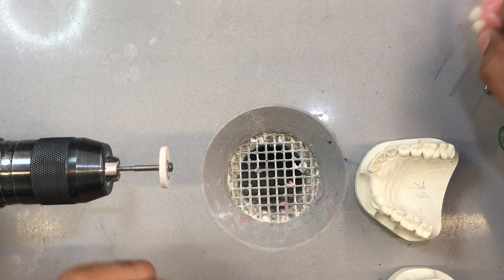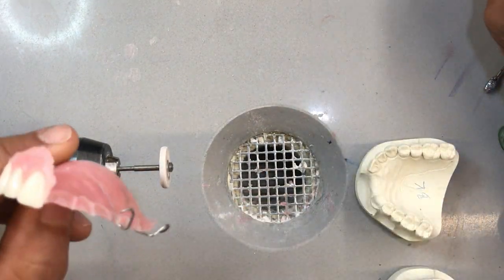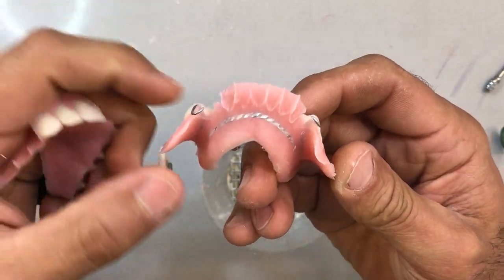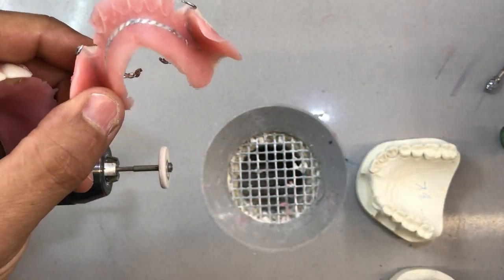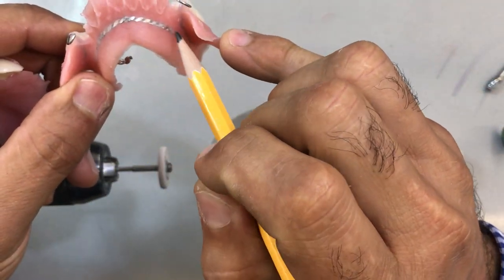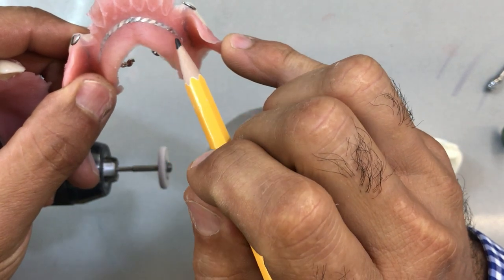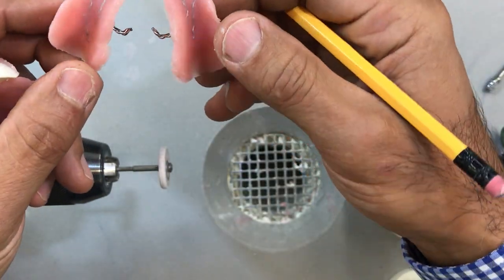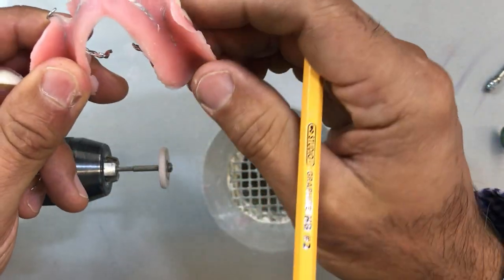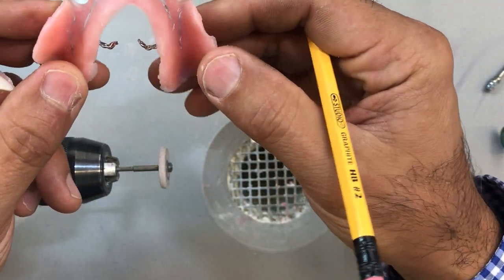After removing our cases from the ultrasonic, they should look fairly clean. Even though I placed the strengthener as tight as I could up against the model, you still have a little bit of acrylic covering it underneath, which is good. So all of my wrought wire clasps are encased within the acrylic base.